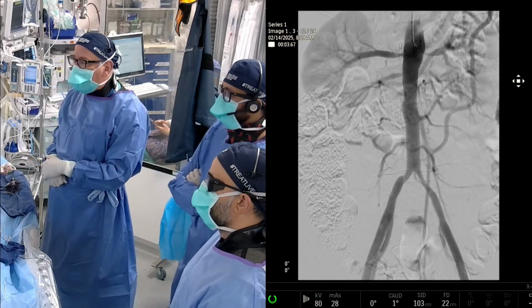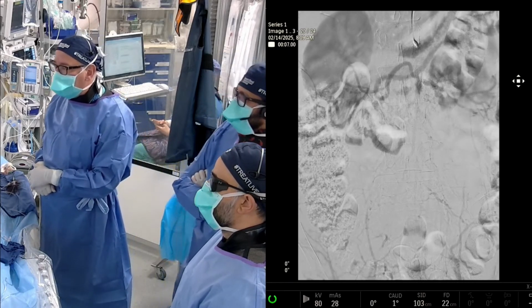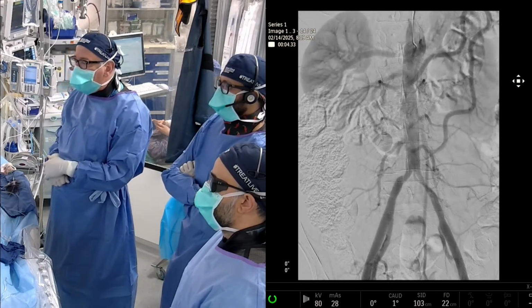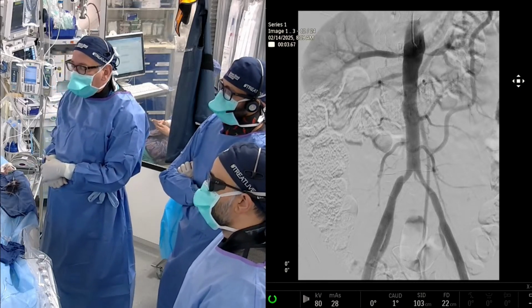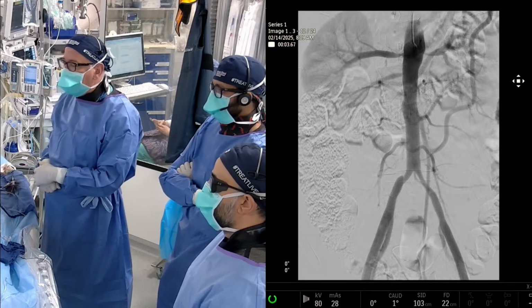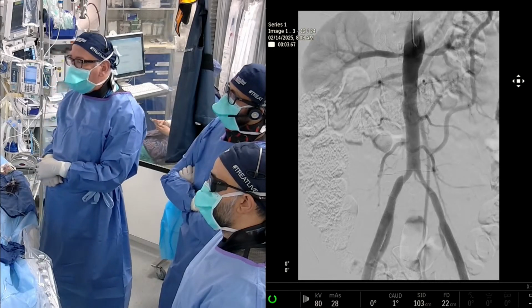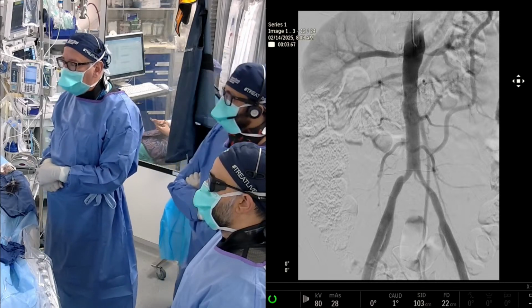You see a very hypertrophied arc of Riolan coming off the inferior mesenteric artery, which reconstitutes the superior mesenteric artery distally through the left branch of the middle colic. You see relatively moderate narrowing of both common iliac arteries with a questionable dissection of the right common iliac artery. And then again, you see a fairly large left accessory renal artery right about the level of the origin of the inferior mesenteric artery, and then probably one vertebral body above that you see an accessory right renal artery.